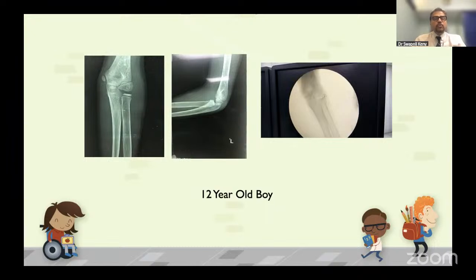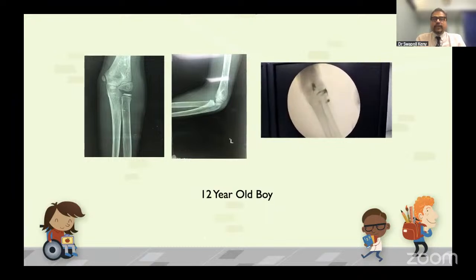There was a query fracture of the lateral condyle. So how do you confirm it? You confirm it minimally invasively by putting a dye across the joint, and this is called an arthrogram. If you see the dye flowing, it first flows across the fracture site in the intra-articular region, and then it will line up the joint cavity.